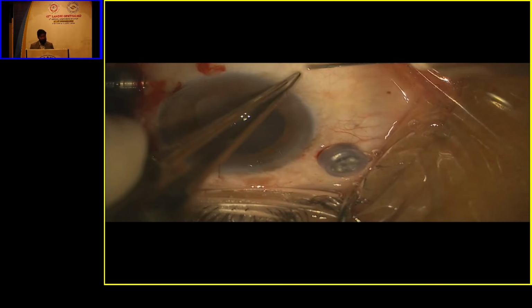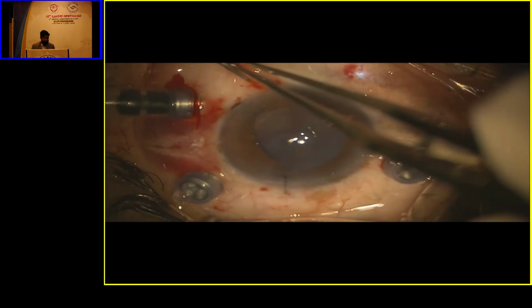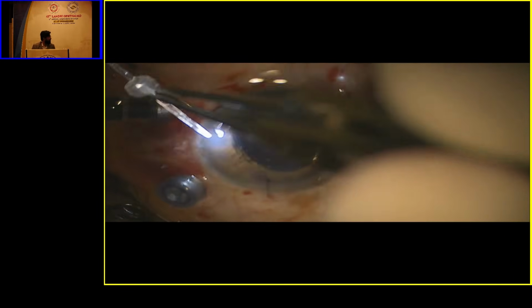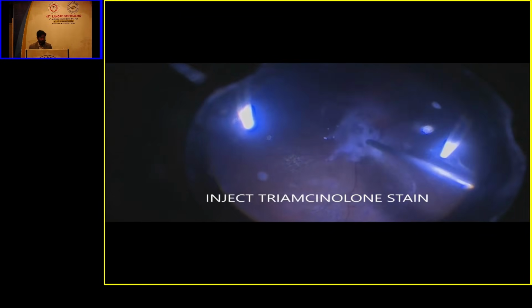This shows the insertion of the chandeliers. Two LED chandeliers were inserted. Now triamcinolone was injected in order to check the attachment of the hyaloid and the posterior vitreous. Forceps were used.